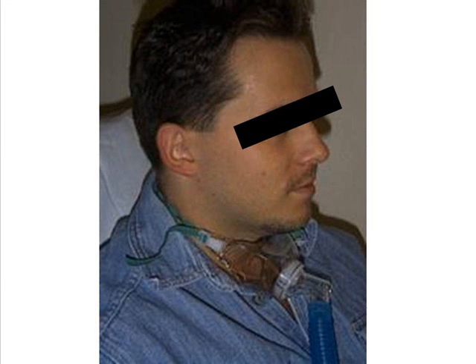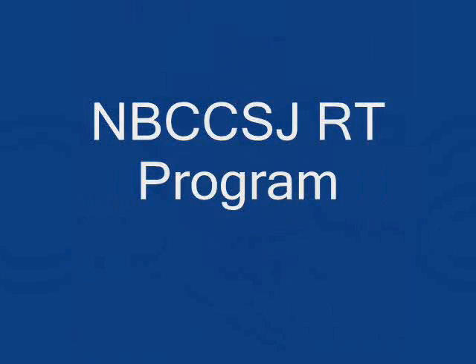Caring for an individual with a tracheostomy mask is a complex task. By implementing some of the strategies in this competency-based objective, and on this short instructional video, it is anticipated that you will develop the correct attitude, skills, and knowledge to perform this task safely.